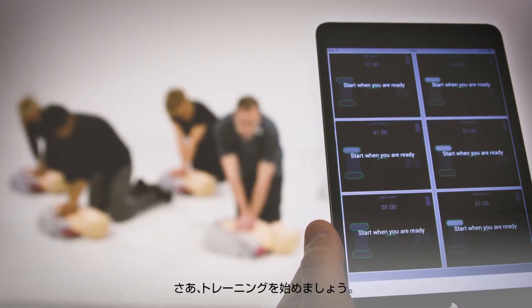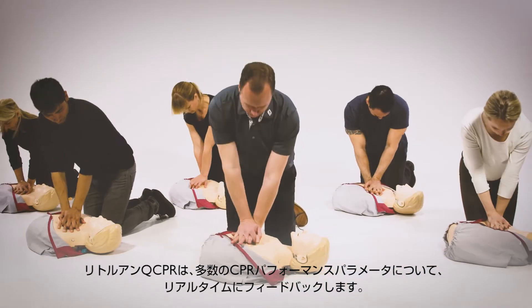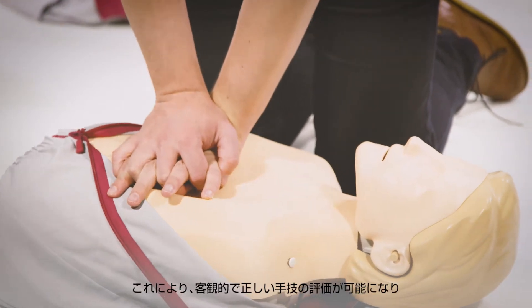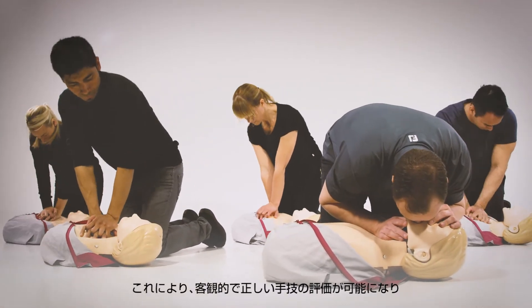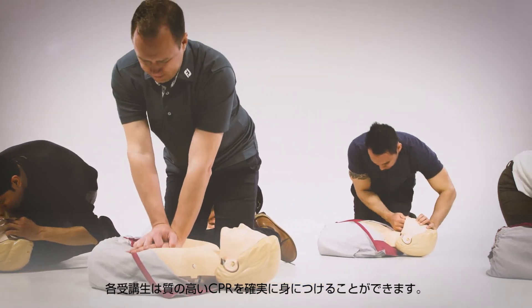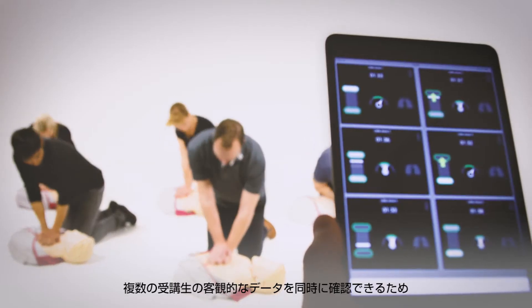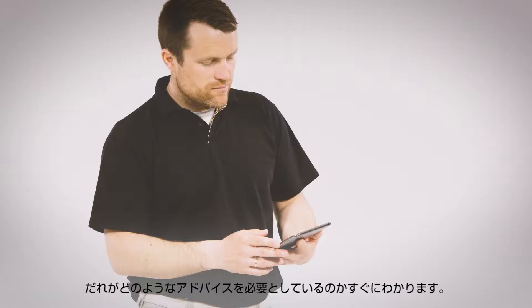Begin your course. Little Ann QCPR provides you with live feedback on a number of CPR performance parameters. This allows you to provide an objective, reliable assessment to ensure that high-quality CPR is being learned by each of your students. With this objective overview of several students at the same time, you can see in a glance who needs help and with what.